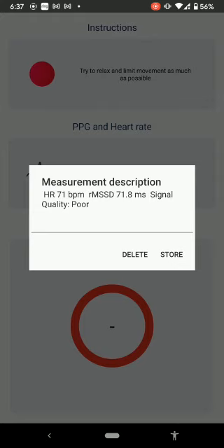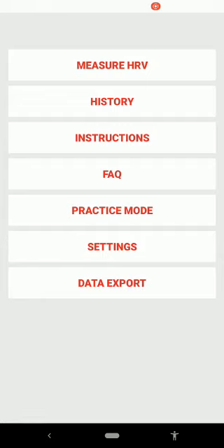To finish up, click 'Measurement Description' and then Store at the bottom right — this stores your data and makes it available to send over to Hope Lab. Once stored, you're back on the main menu. Now the next thing is how to actually send the data to Hope Lab.